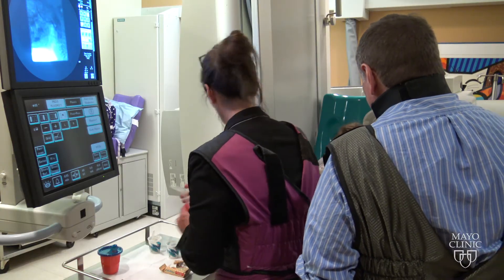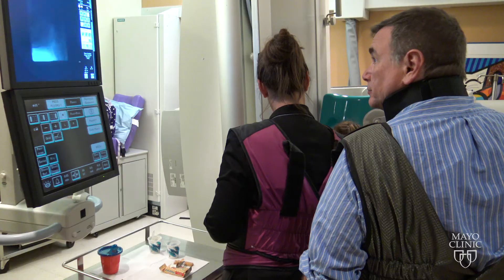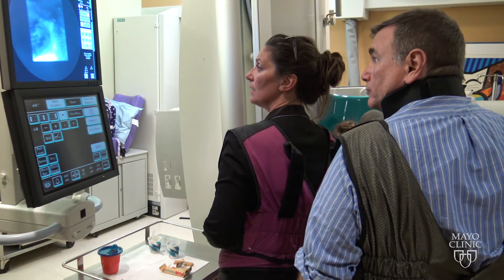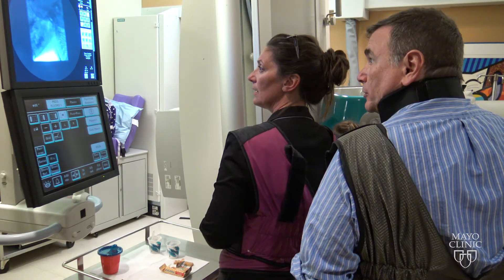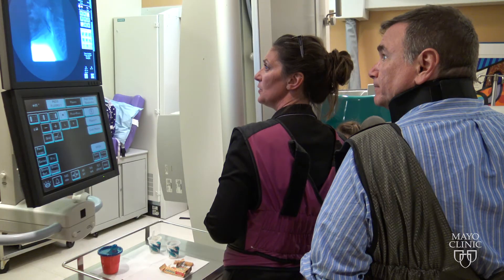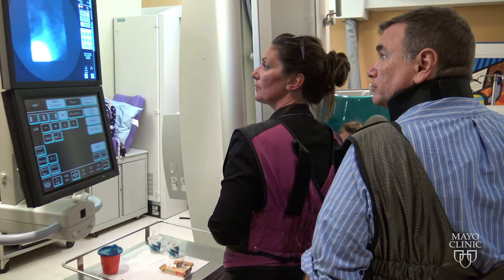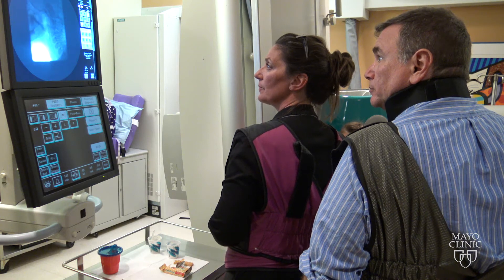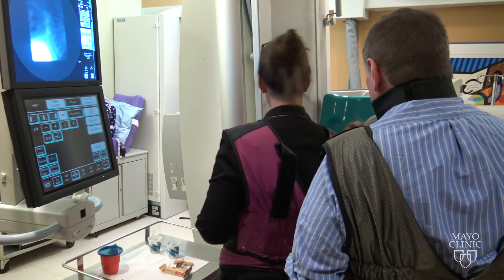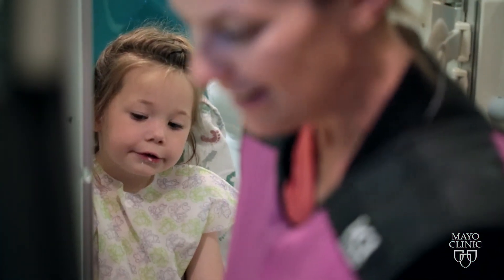Should we wash it down with some liquid? You can hold the cup if you want to. There you go. And let's do one more. Can you do one more for me? Those are nice big swallows. Very good.